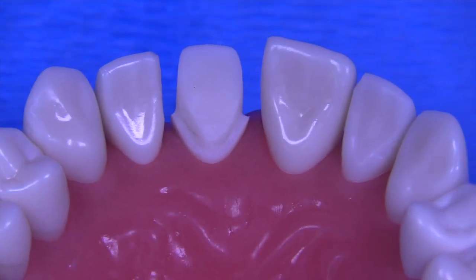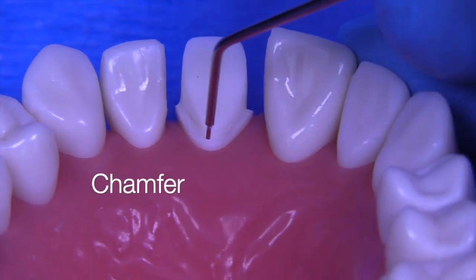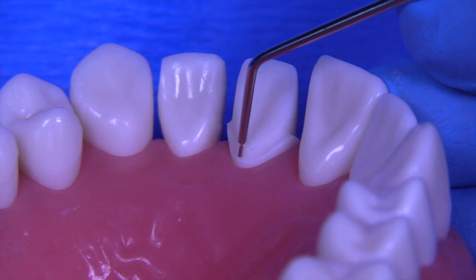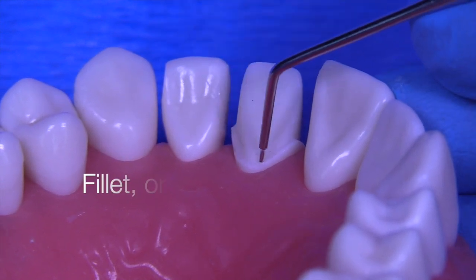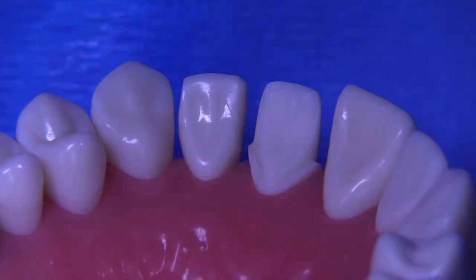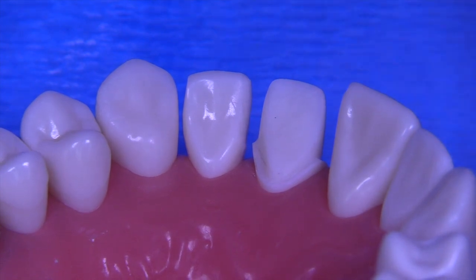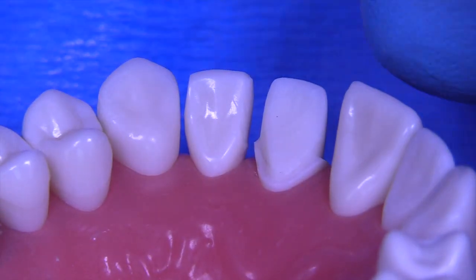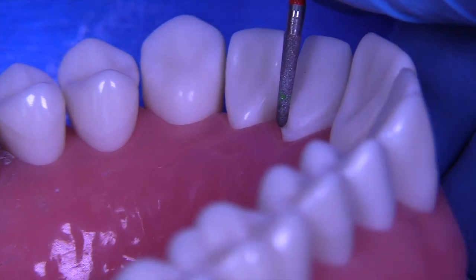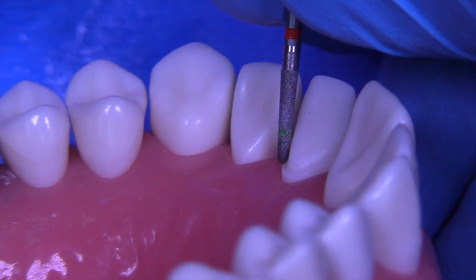So when we look at it from the lingual side, we're looking for a chamfer. And so what we're looking for is a margin that curves and is angled downward. And what I see is something more of a fillet margin or maybe a rounded shoulder. So if we utilize a burr that has a shape that is more towards this type of shape, like this 8878K, this is going to give you the proper chamfer. Half of the depth of this burr will do it for you, but you see how it doesn't really conform to that shape, does it?